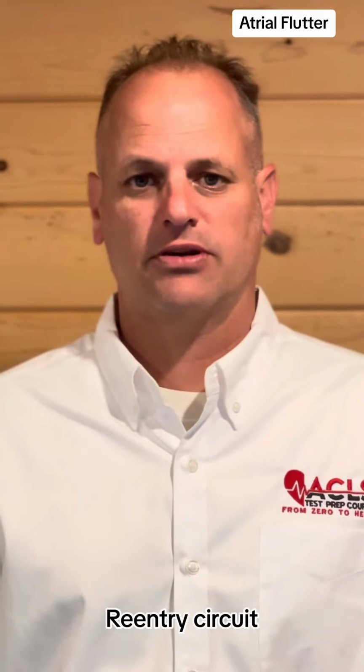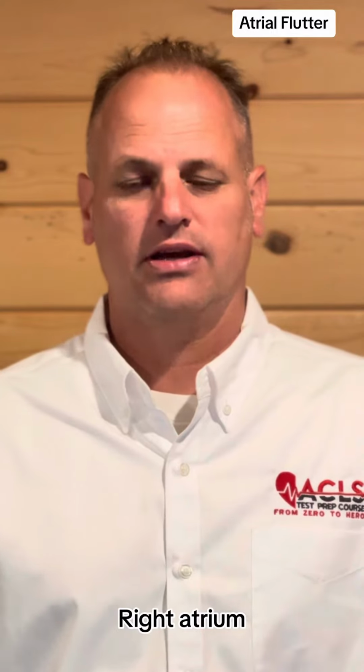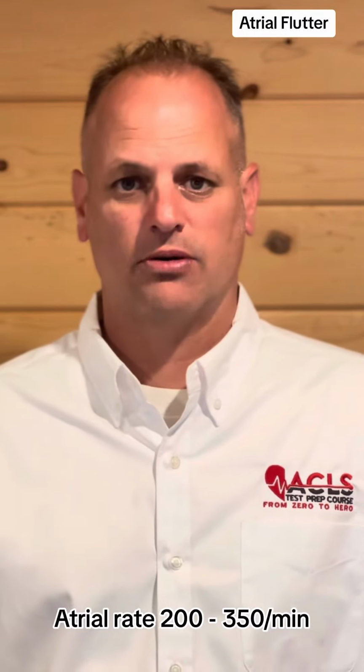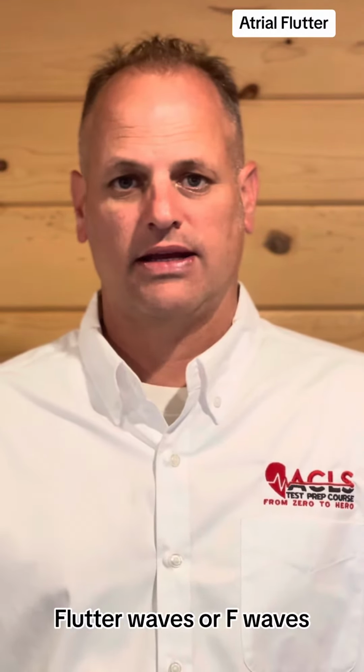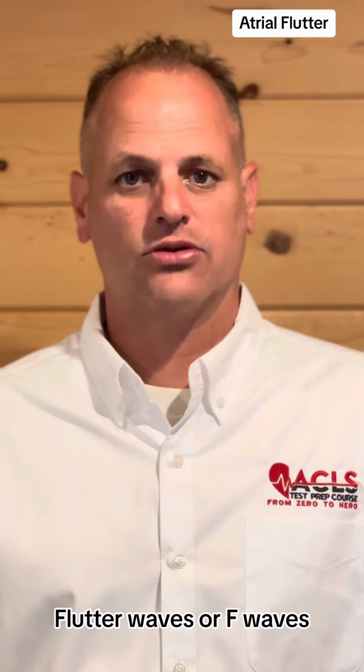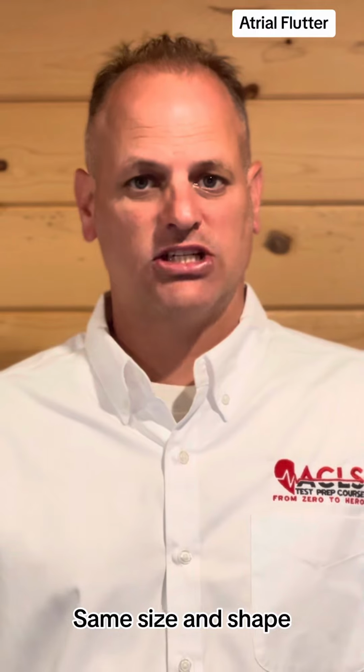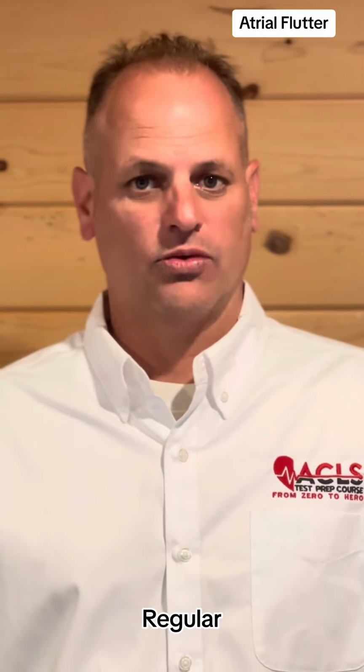Atrial flutter. So atrial flutter is one large ectopic focus re-entry circuit in the right atrium. Now your atrial rate is going to be between 200 and 350 times per minute, and the atrium are forming flutter waves or F waves. And these F waves are going to be the same size and shape, and it's going to be regular.